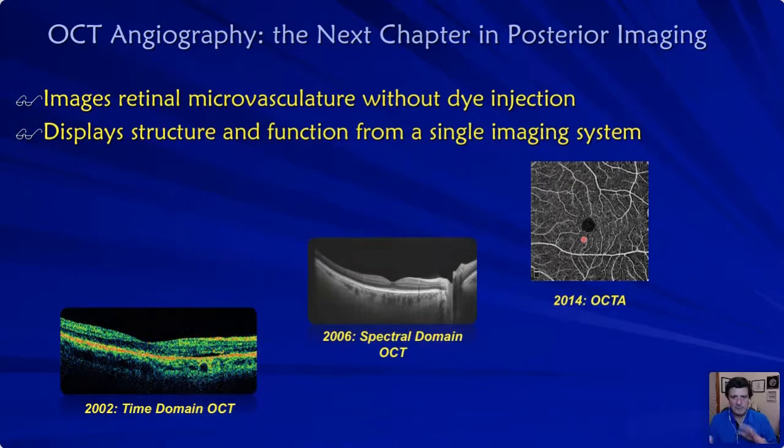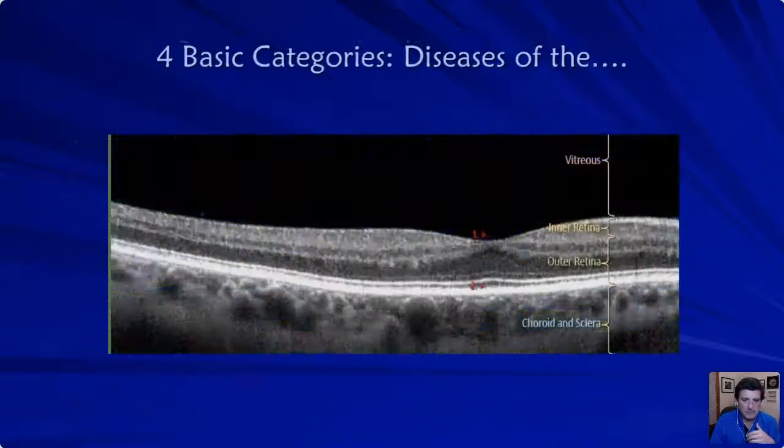The 90 is a little wider field, while the 78 or 60 gives you a little better depth of perception but narrows down your field. So I have both in my office, and I use those 90s and 78s, but I also have the B-scan and the angiography. I'm going to bet if you have an OCT in your office, someday you're going to transition into angiography, because you get lots of great data, and it can really help solve some mysteries and help in the diabetic and the macular degeneration patient.